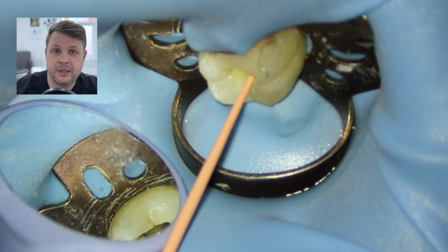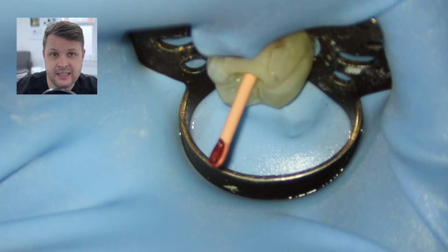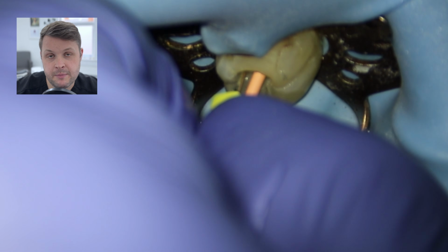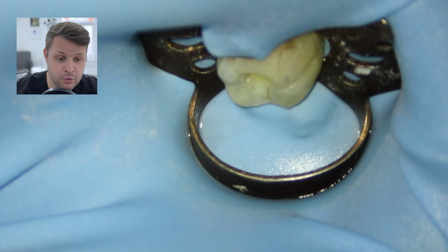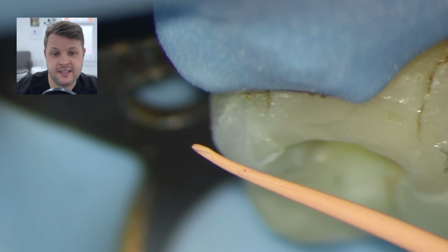So I'm going to place my GP point in the distal buccal canal to length, and then place a size 10K file, which can be any file really, in the contralateral orifice. Then I'm going to mark the GP point through this other orifice with this hand file, pull the GP out, and inspect the end. When we look at the end of this GP point, we can see that it's marked the GP point right at the tip, okay?